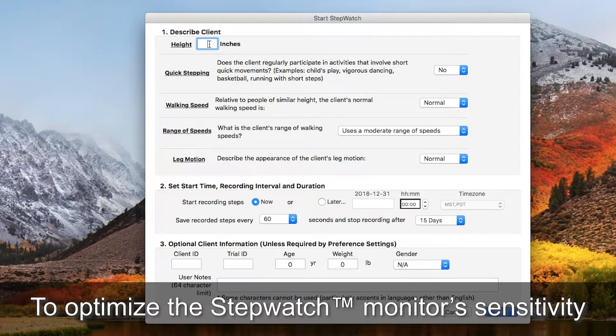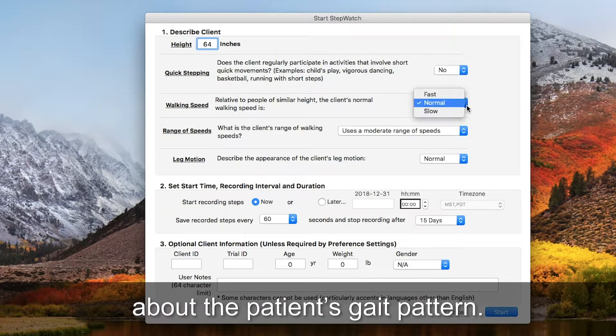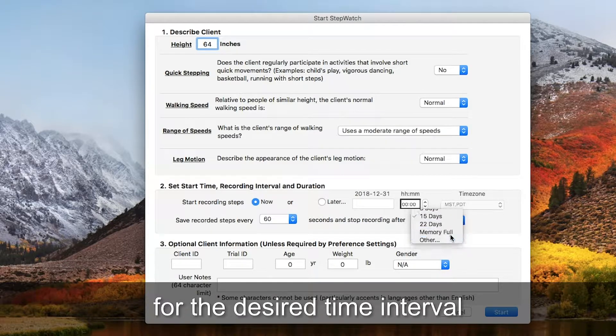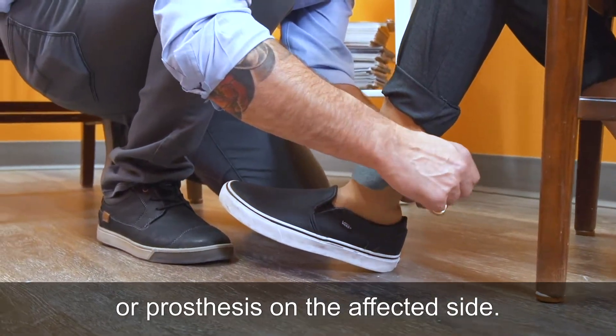To optimize the StepWatch Monitor's sensitivity, enter the patient's height and answer the four questions about the patient's gait pattern. Ensure that it is recording for the desired time interval and click Done.